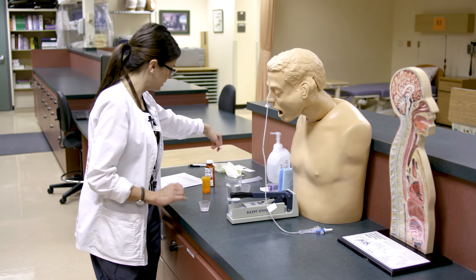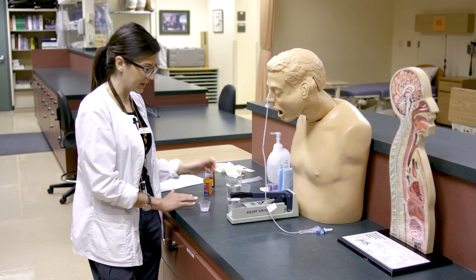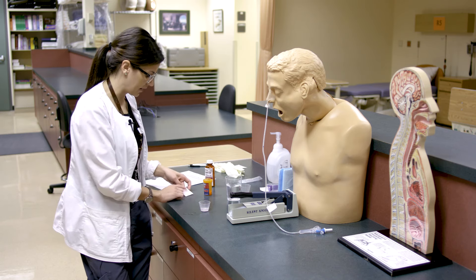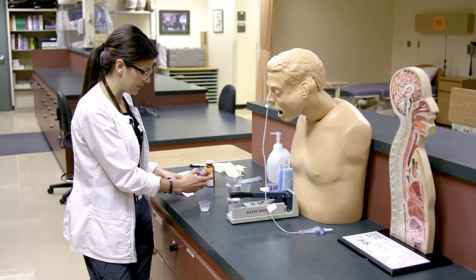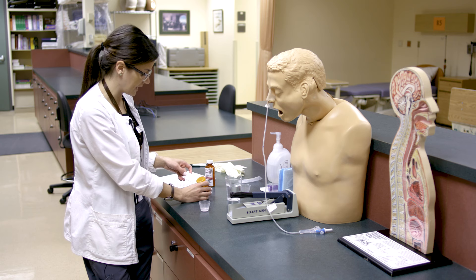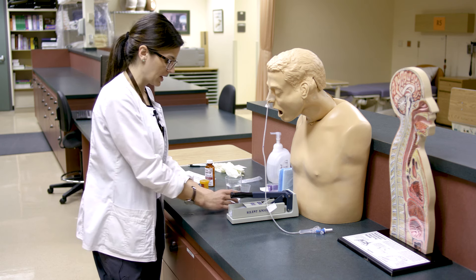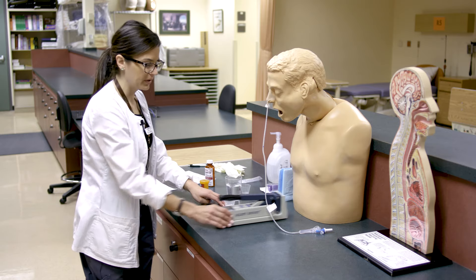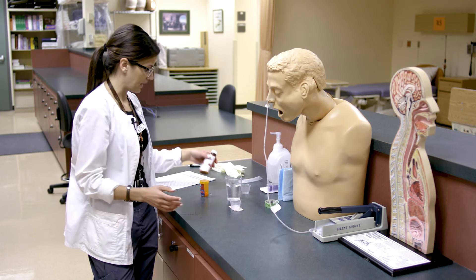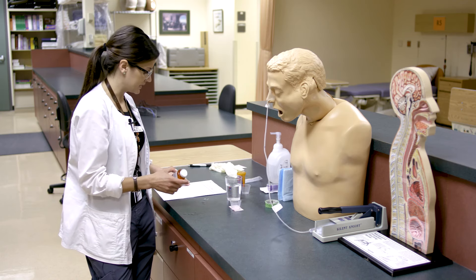It's very important to label the med cup because it's hard to tell what's in it. We'll label it with the patient name — Chris McPherson — the drug name — Benadryl — the dose of 25 milligrams, which is one tab. Then add the date, time, and your initials. We're done with the Silent Knight now.